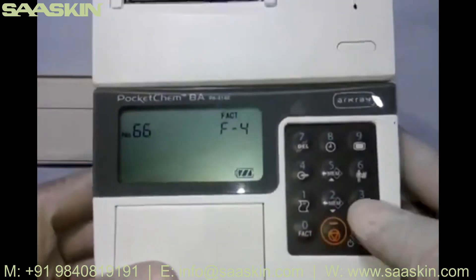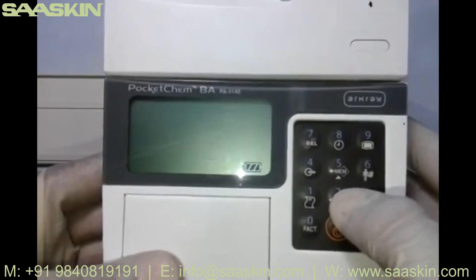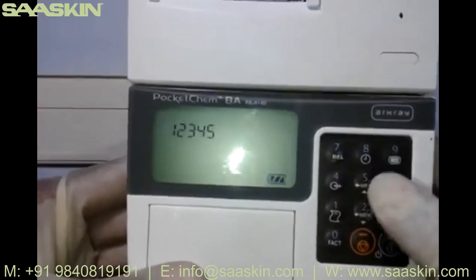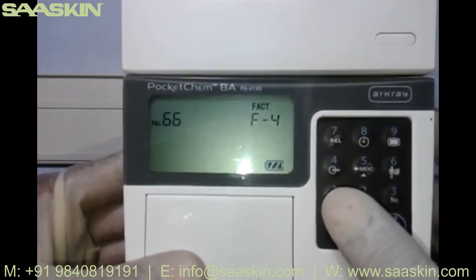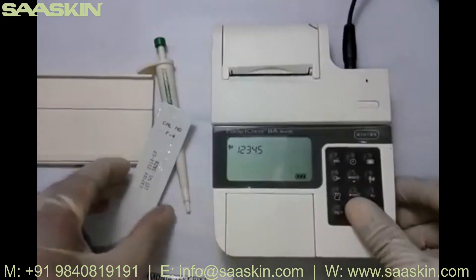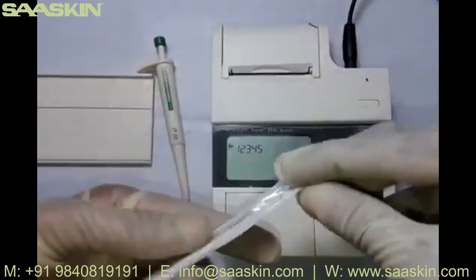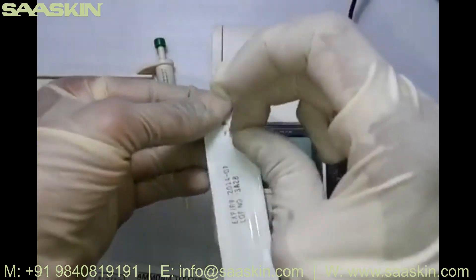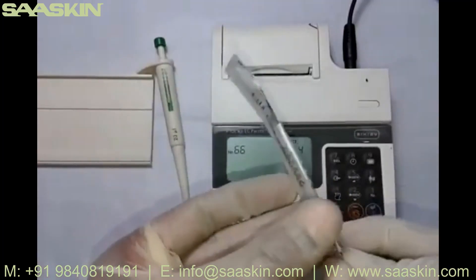To enter the patient ID, press button 6, then enter the patient ID number — for example, 1-2-3-4-5 — and press enter. The display will confirm serial number 66 and patient ID 12345. Once programming is done, take out one strip from the aluminium foil pack by using the cut slot provided.